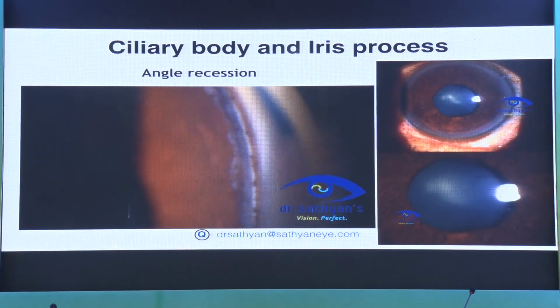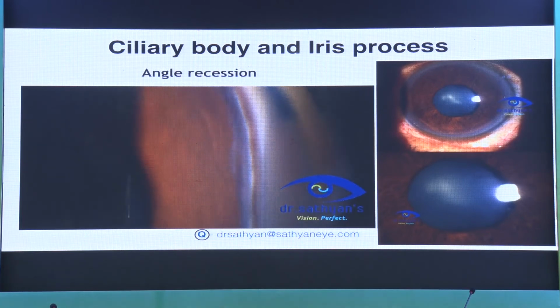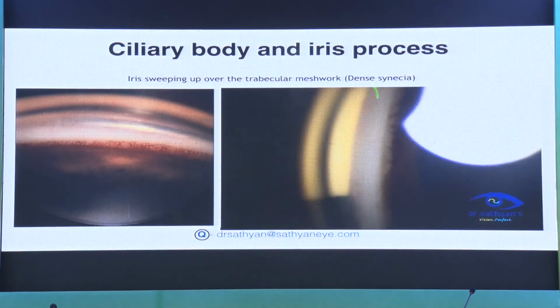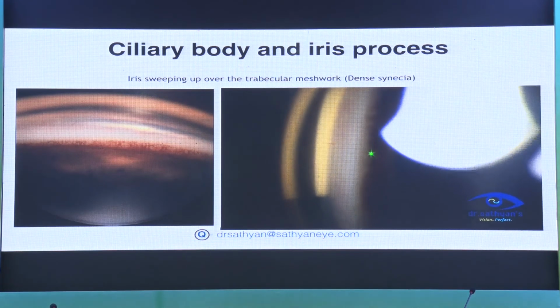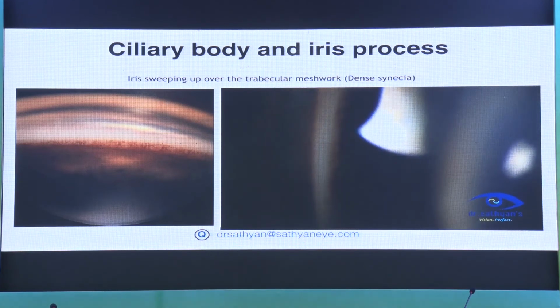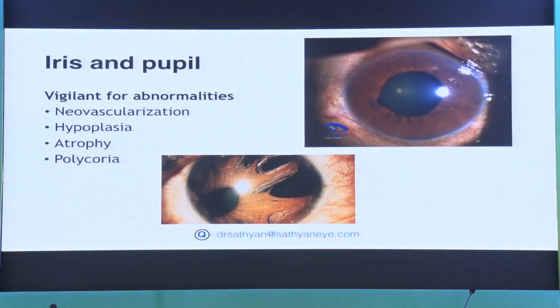Why I am showing you this little longer video is that you should never forget this in your mind, how the wide ciliary body band can be visualized. And again, like what Prasanna was showing you about the iris processes, filiform processes, small iris processes, you can still see the background, you can still see the structures very clearly. And of course, this is the same.